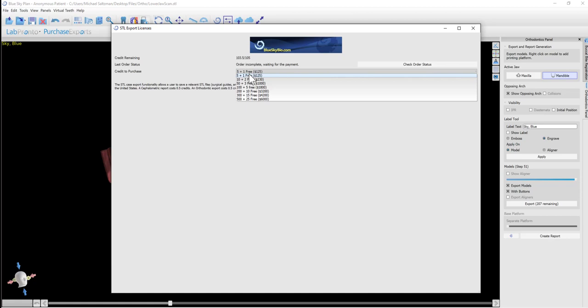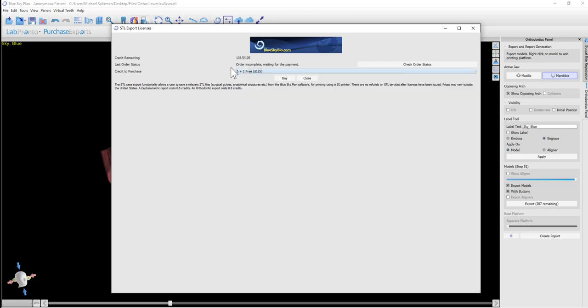An ortho export is half of that, so that would be around $10 per export of a draw, again irrelevant to the number of models or aligners. The larger the package you buy, the cheaper the export credit gets. The cheapest package puts the export at $5 for an ortho draw export.